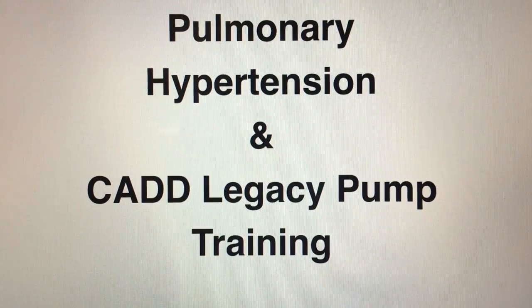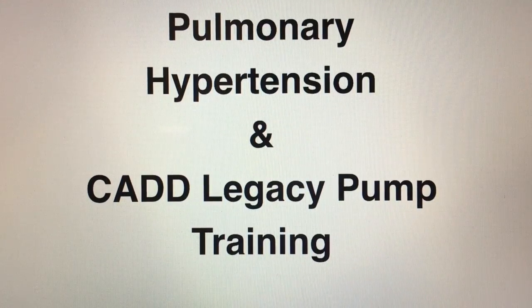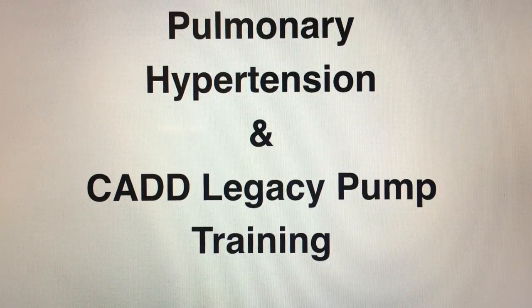This video is designed to provide you with limited background information on pulmonary hypertension and some of the medications used to manage the disease. While the main focus of this video will be on learning to use the CADD Legacy pump, determining the dwell volume, how to prime the line, cassette changes, as well as managing the patient.